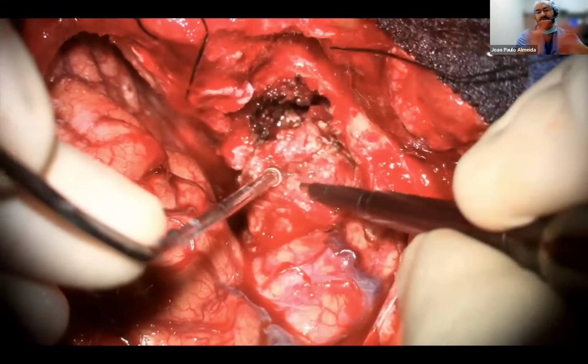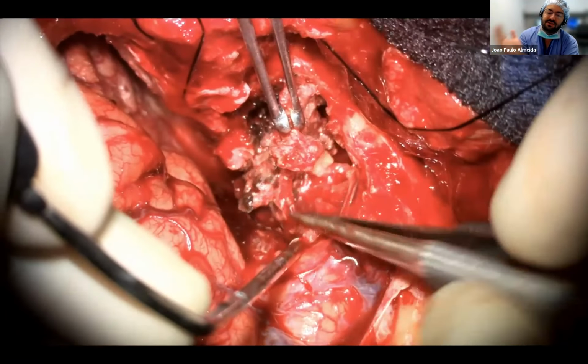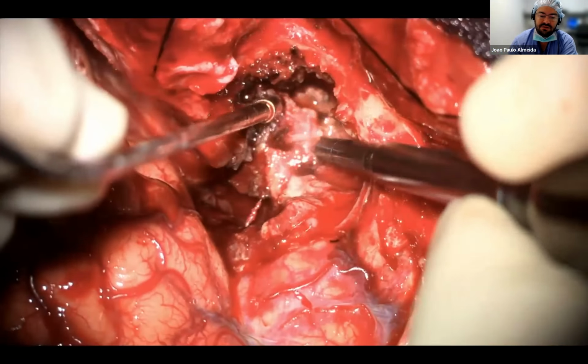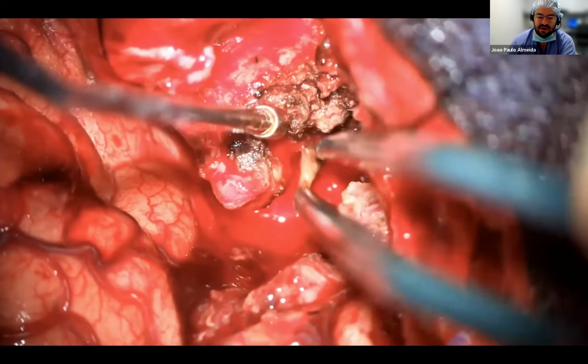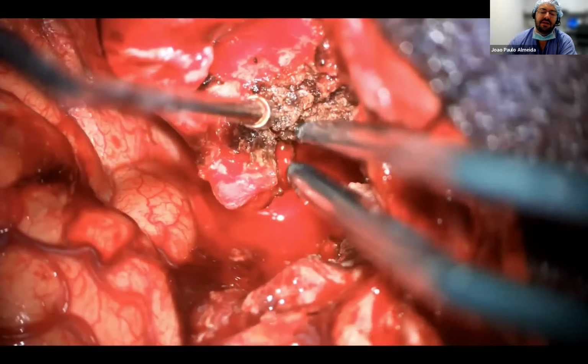And we're gonna be kind of like fishing that tumor out from the bottom. As we bring this tumor to the surface, we debulk more and more. So the usual classic steps in meningioma surgery. And then this tumor is, you see, it's vascularized already. You already kind of like killed most of the supply in that aspect.